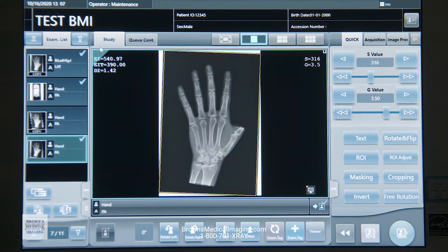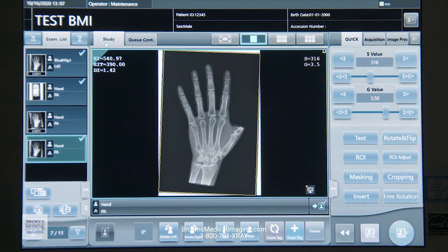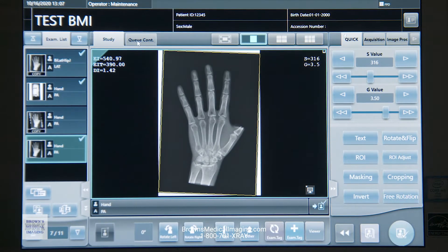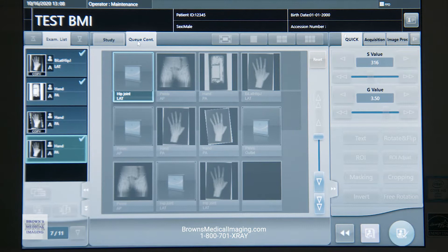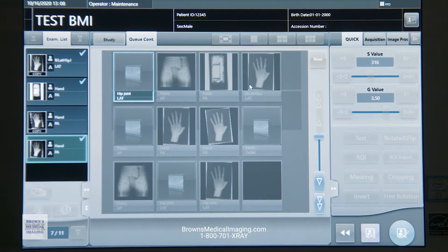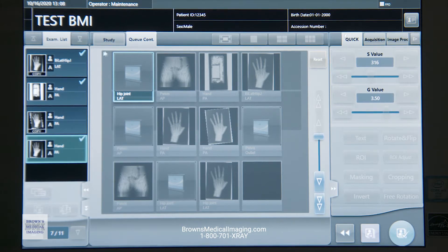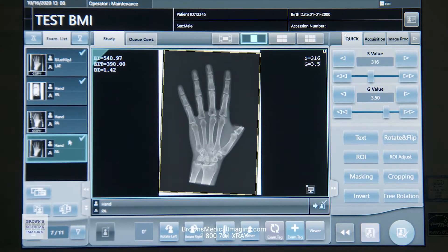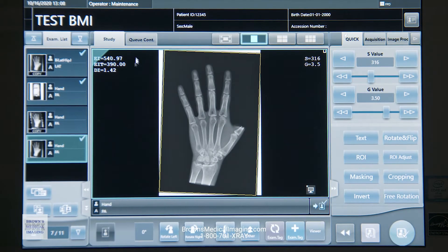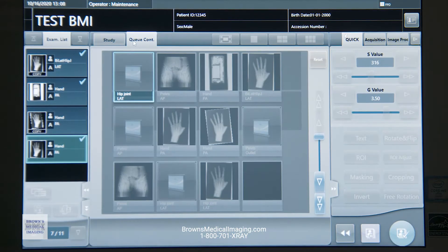Back up to the top, we've got the study tab versus the queue tab. The queue tab is just going to tell me in what order it's going to send to PAX. We can move those around if need be, but generally speaking, the way that you shot them is the way it's going to pull up in the queue.